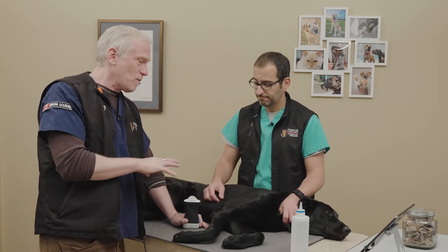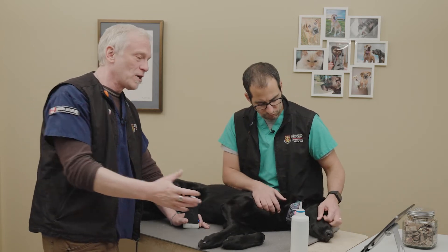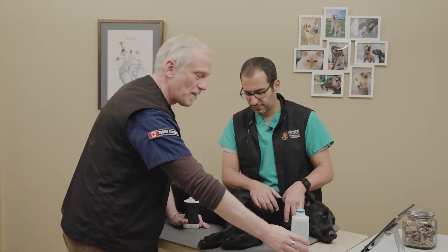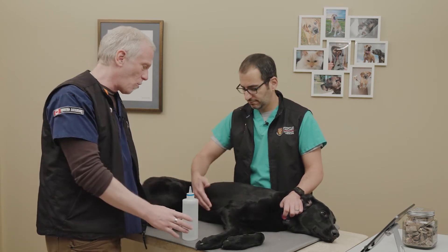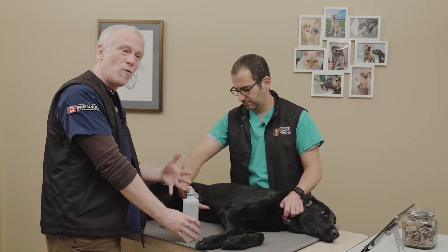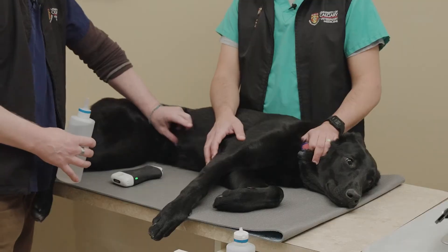We're gonna go ahead and show you that in real time, and then once we've got this exam done, we're gonna show you each site and all the questions we answer at those sites. This is just a general overview of how we do this five-point APOCUS exam.